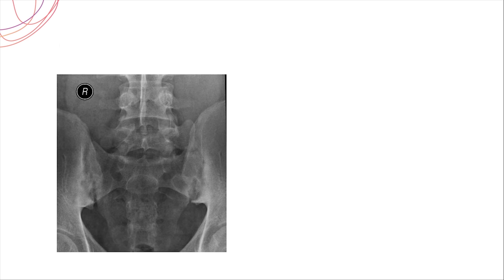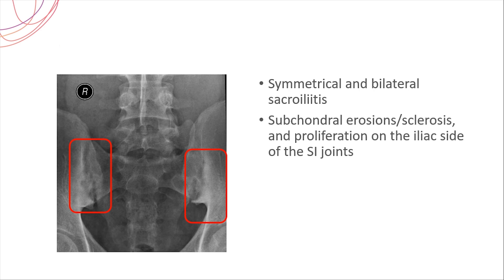The essential diagnostic feature is to demonstrate sacroiliitis. The most important joint to examine is the sacroiliac joint, and the earliest finding of ankylosing spondylitis is symmetrical and bilateral sacroiliitis, as seen in this picture. Subchondral erosion, sclerosis, and proliferation — especially on the iliac side of the sacroiliac joint — are very common. The sclerosis is highlighted here.